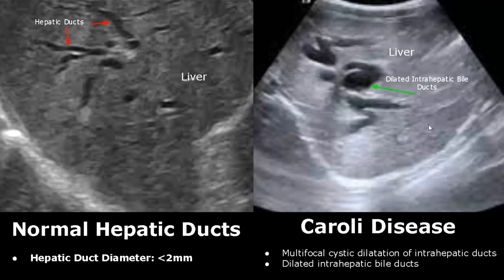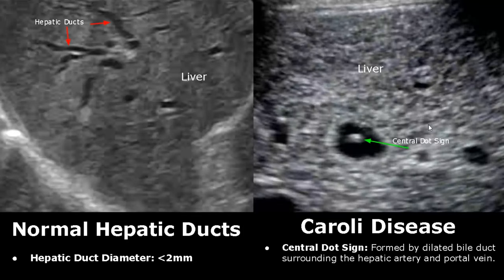The central dot sign is formed by a dilated bile duct surrounding the hepatic artery and portal vein. This dot is formed inside the bile duct by either the hepatic artery or portal vein.